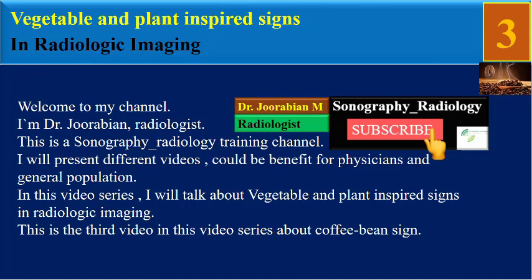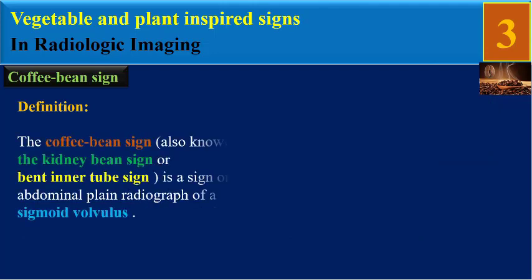In this video series, I will talk about vegetable and plant inspired signs in radiologic imaging. This is the third video in this series, about the coffee bean sign. What is the definition of coffee bean sign?